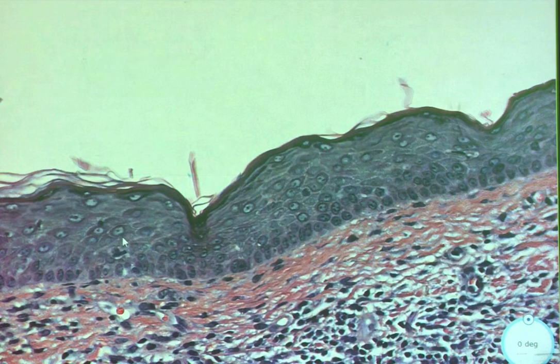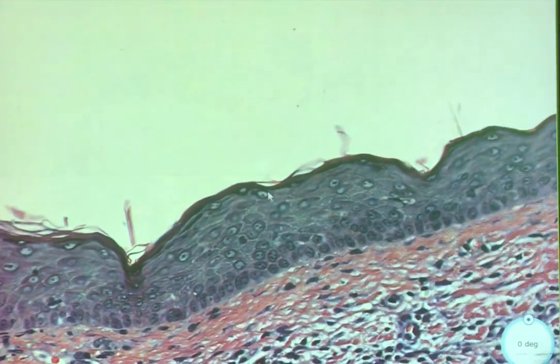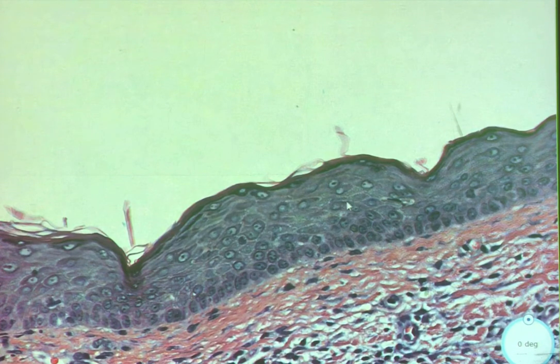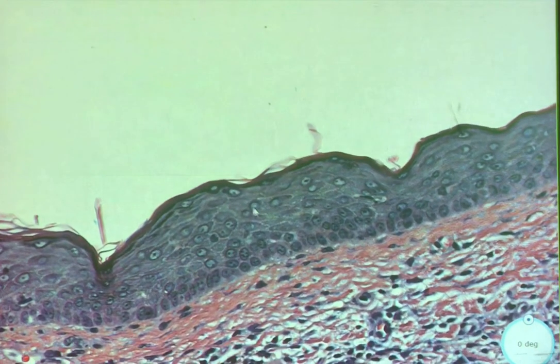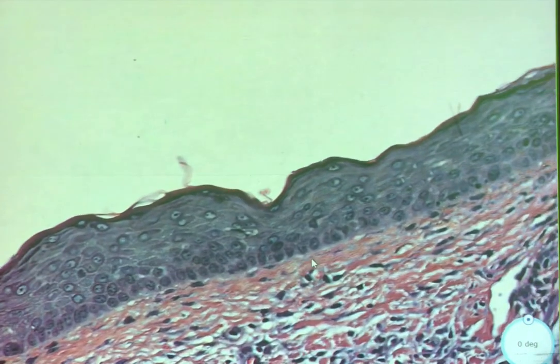These cells are retaining their nuclei, so there is parakeratosis. Are they? Parakeratosis is within the very superficial layers. Most of the superficial keratin looks like maybe it has been rubbed off. What we're seeing there, I think, is a relatively normal granular layer still. There's maybe a little loss of maturity, but the basilar half of the epidermis is more where you want to look in this. Okay, yeah, they look more atypical, like they don't look normal, right?